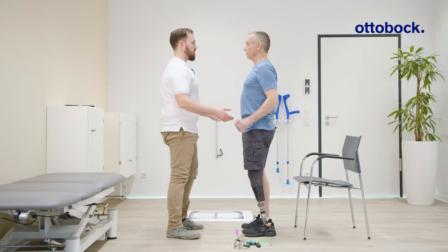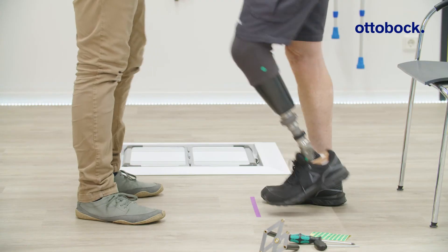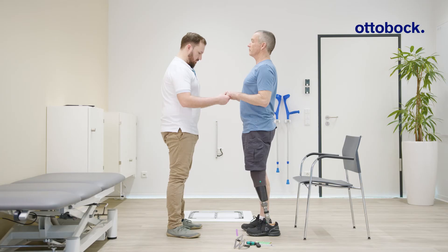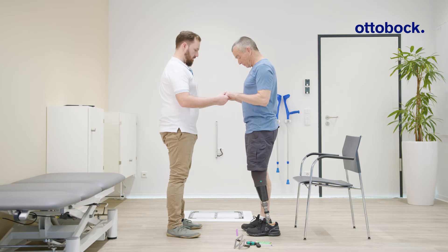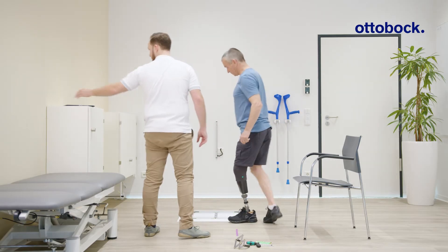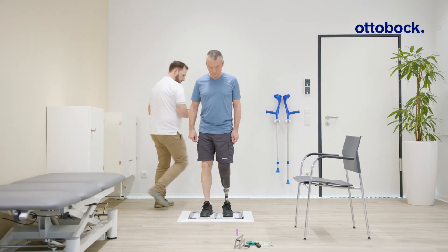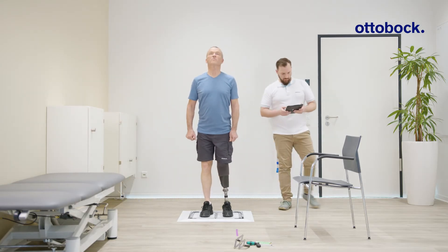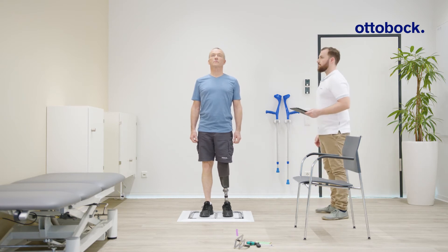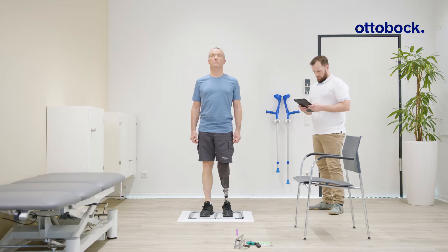Make use of the step test to check if the toes of both feet line up. In this case, the teleo adapt stays behind compared to the contralateral leg, which can indicate a wrong AP position of the prosthetic foot. Observe the load line on the 3D laser posture tablet and the user's trunk position.